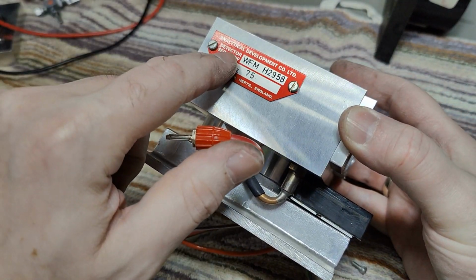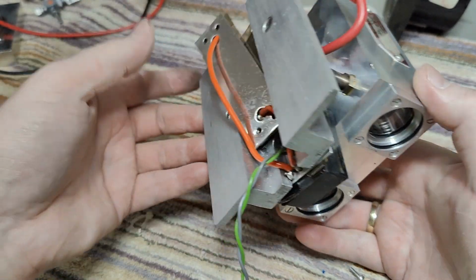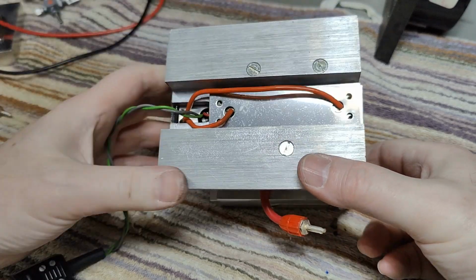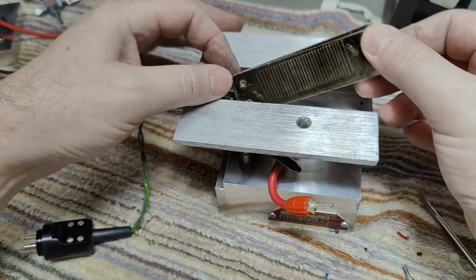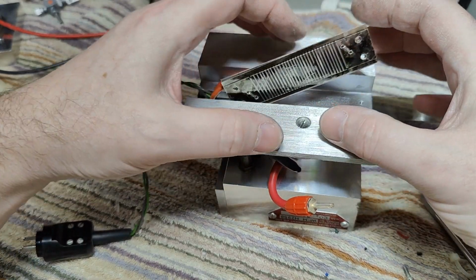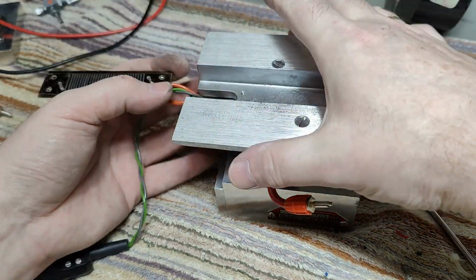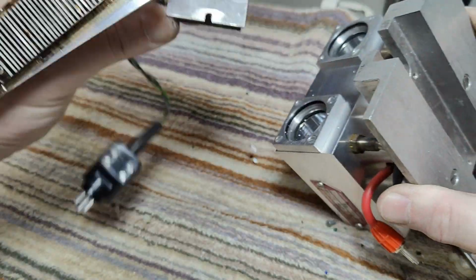See, it also says this is the detector. So I'm of course not super surprised to see what is going on here. And down here at the bottom, look at that. So this is a heater. So it's able to heat up this entire unit. And this little piece here is probably, yeah, look at that. Oops.